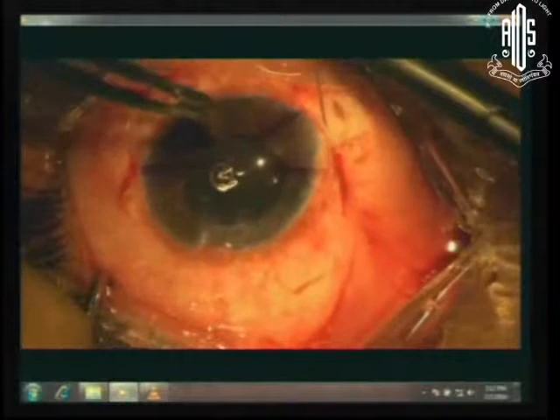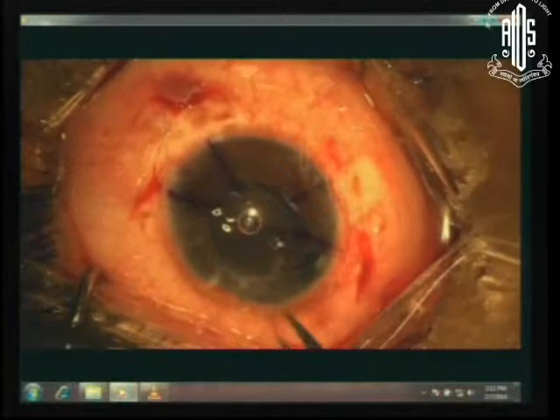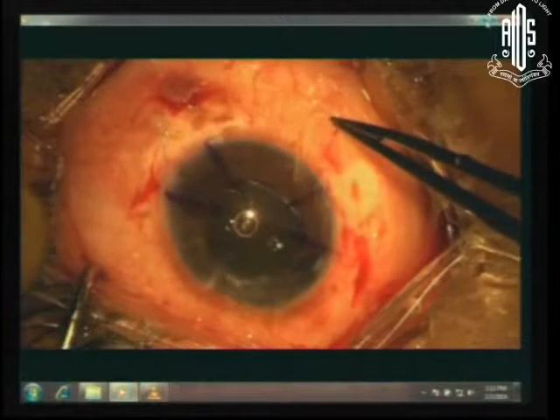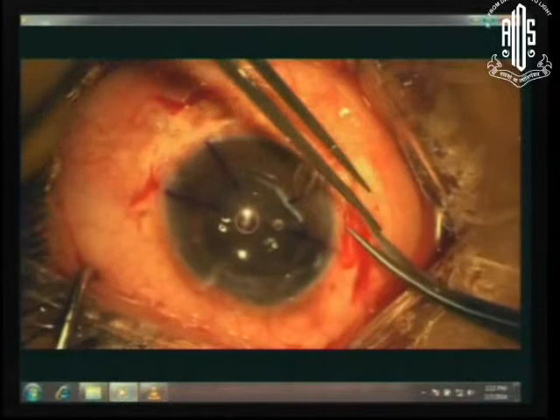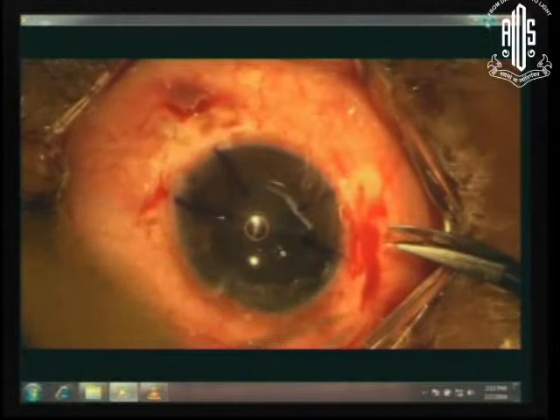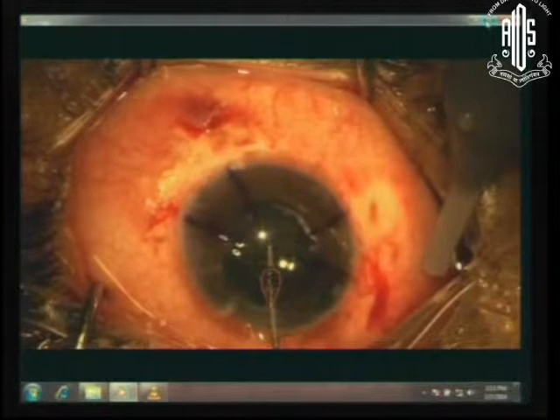As you look at the lens, you know it's a PMMA lens, and you know for sure that if you try pulling it out and trying to gum it to the surface, probably one of the loops will break. So this is the safest way of handling it. You apply your sutures, tighten them, and once the sutures are tight the suture goes into the depth of the incision. Trim it and cut it. You no longer have to bother about the conjunctiva — the conjunctiva will retract upon it by itself. If there is any edge left over, all you need to do is knock it back into place. All you now need to do is press the lens — till now the optics were lying anterior to the iris; now they are lying posterior to the iris. So you manage to recenter a decentered lens with a very simple and easy method.